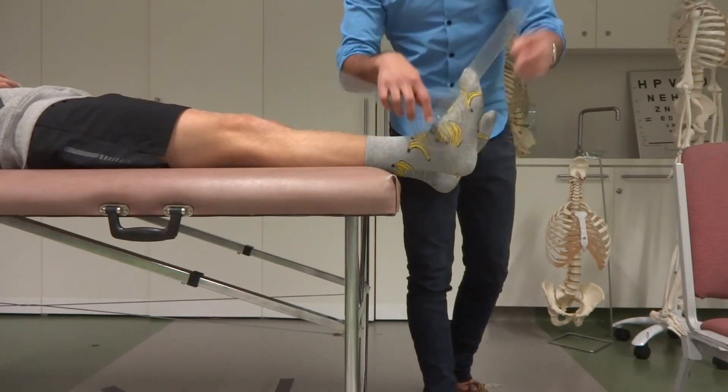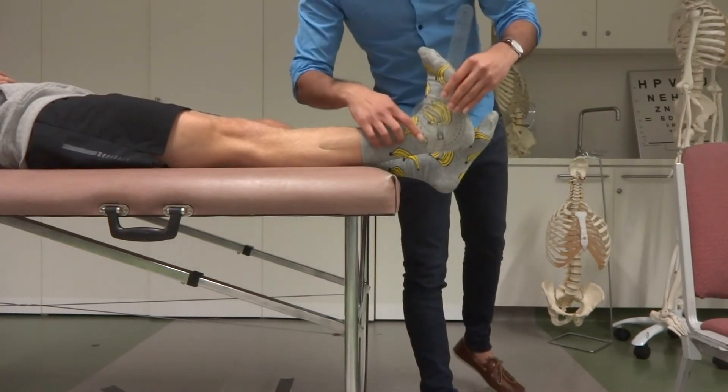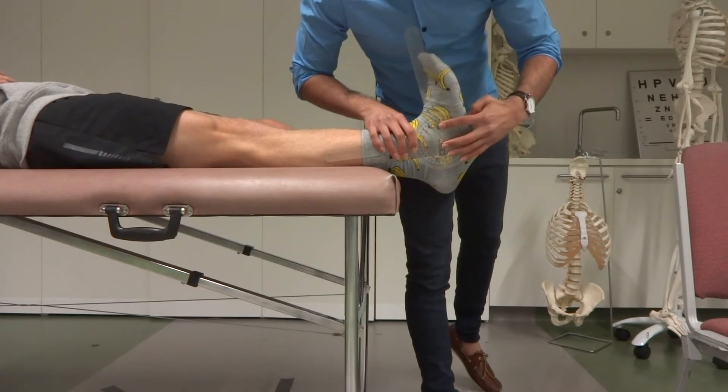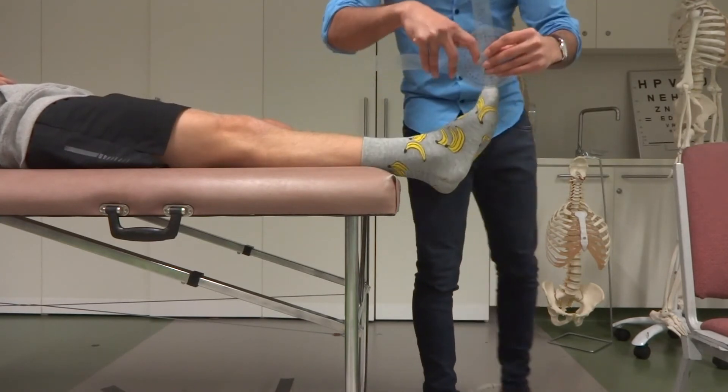I'll get some dorsiflexion going — I'll ask Jack to dorsiflex his ankle as much as he can. I'm going to take my three landmarks, noting that my movable arm is parallel with his fifth metatarsal, and then pull that off.